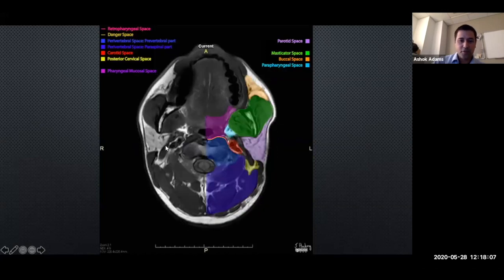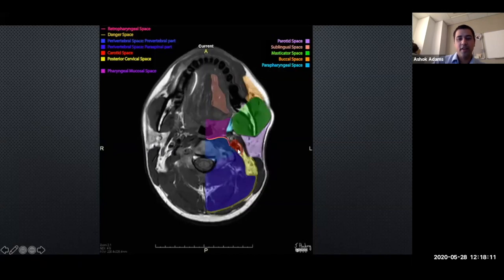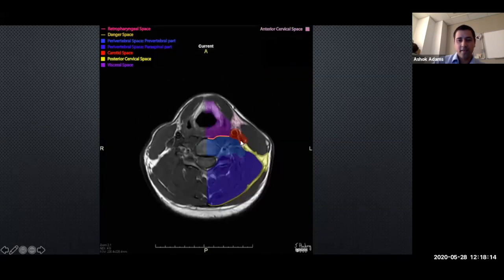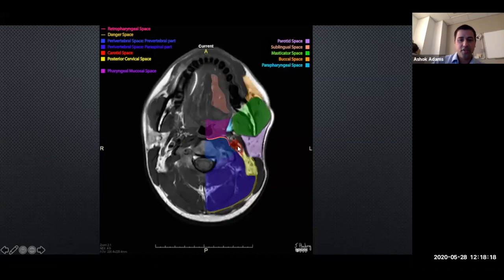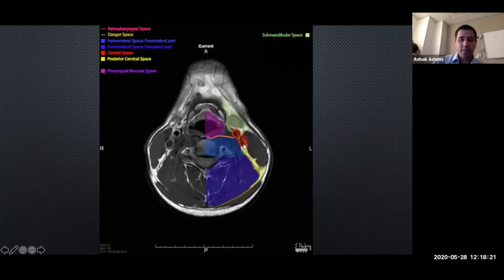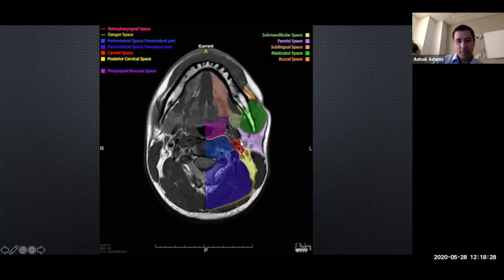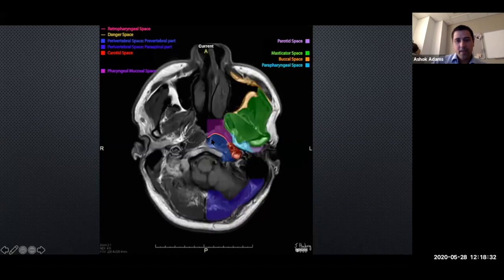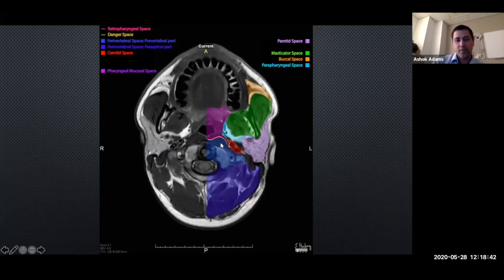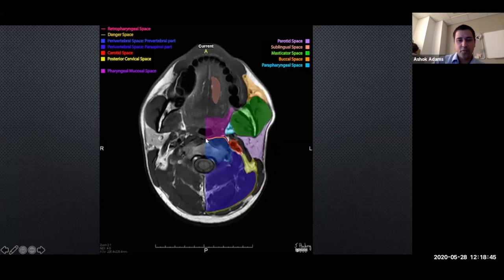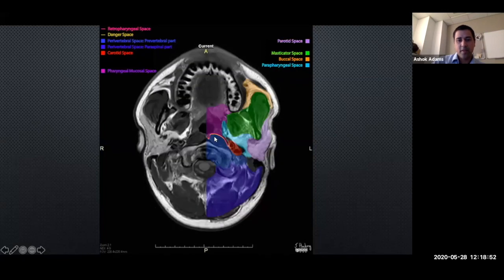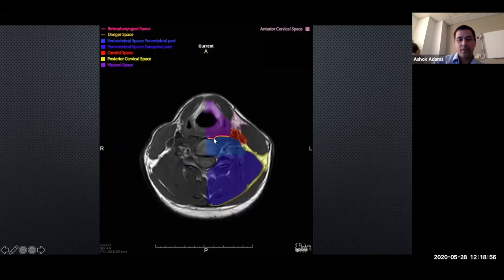Nicely in red on the other side is the carotid space: carotid artery, jugular vein, vagus nerve running all the way down the neck. With carotid space pathology you're thinking about glomus tumors, vagal nerve tumors, or lymph nodes. Coming medially, the blue area is the perivertebral space encompassing all of the spine - you can see the spinal cord, anterior arches of C1, and the prevertebral muscles. The retropharyngeal and danger spaces also run all the way down the neck.